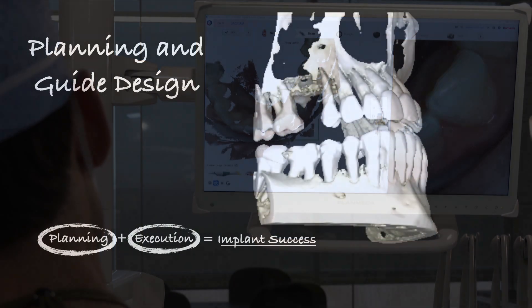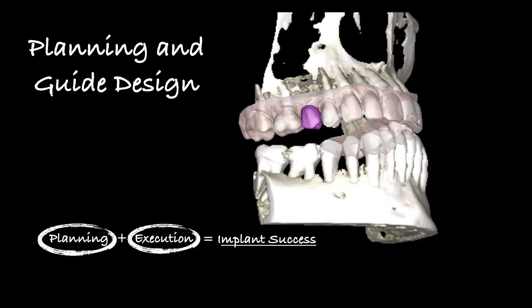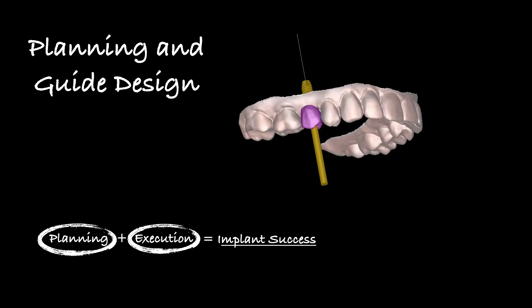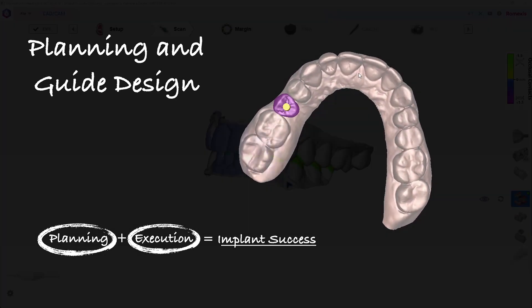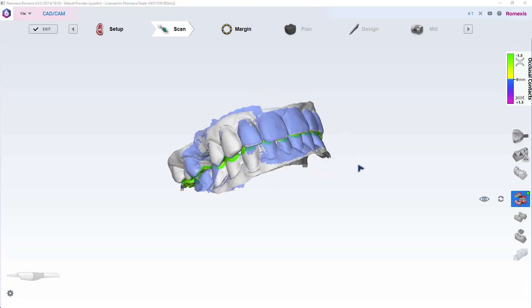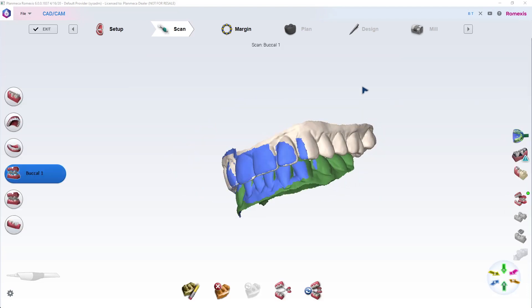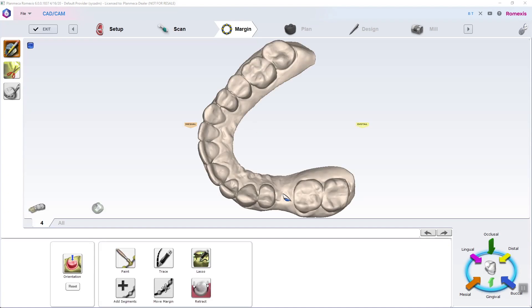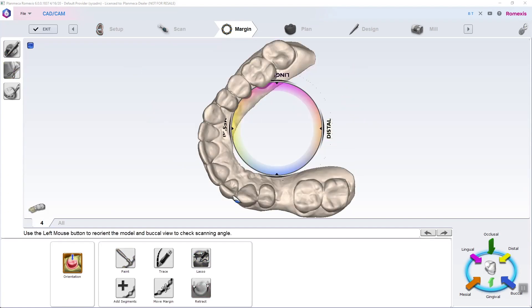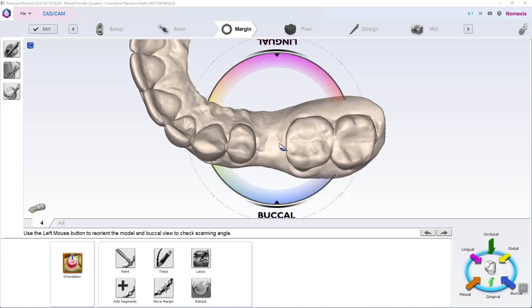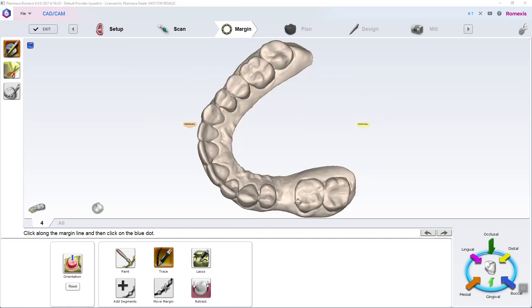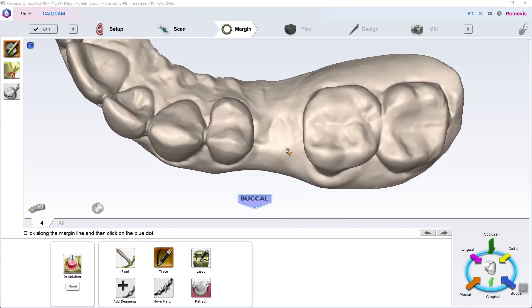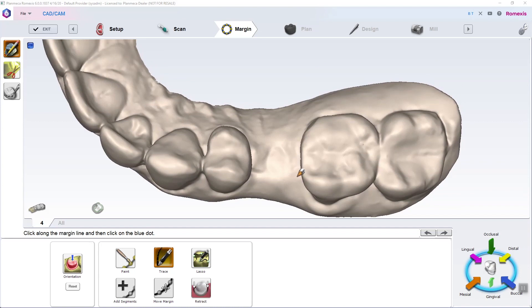Now we have everything we need to plan our case. The patient had previously had tooth number four — or tooth number fifteen for our international friends — extracted due to vertical root fracture, and we did ridge preservation grafting at the time of extraction. Twelve weeks later, we brought her in for her initial consultation, did our intraoral scans, and captured the CBCT. Now we're looking at these images of the intraoral scans in PlanCatEasy, and we're going to do a quick but powerful digital wax-up so that we have an idea of what the future restoration should look like.